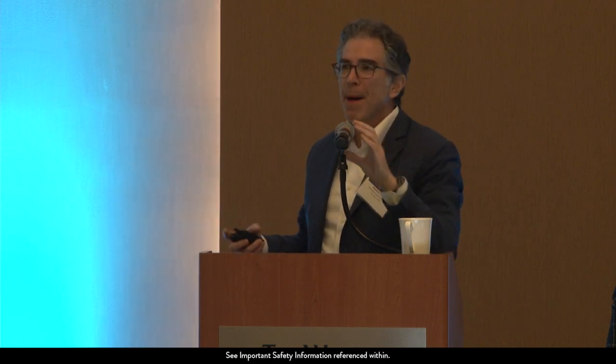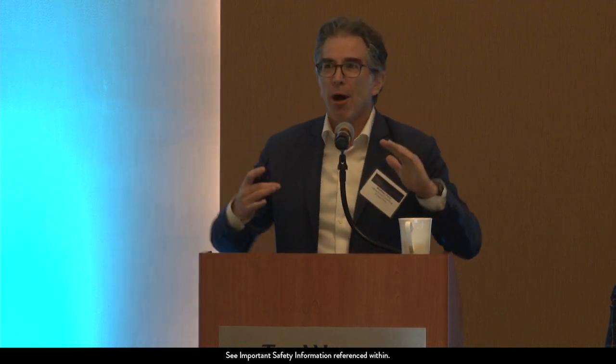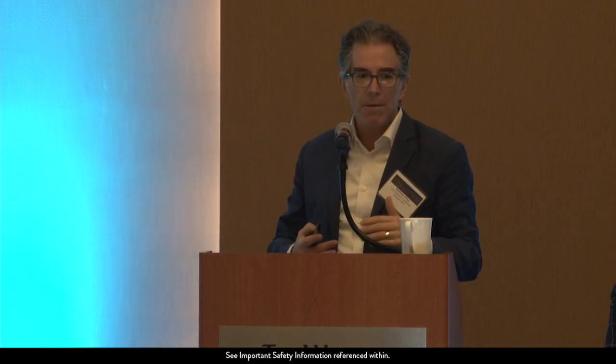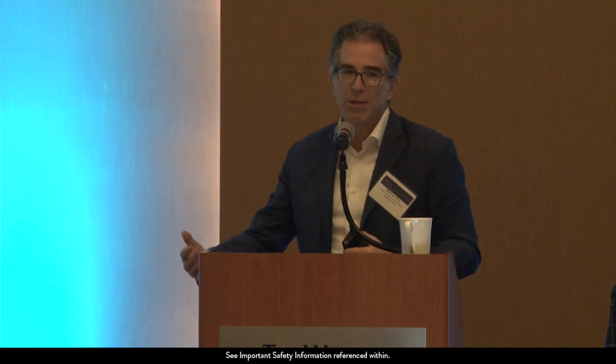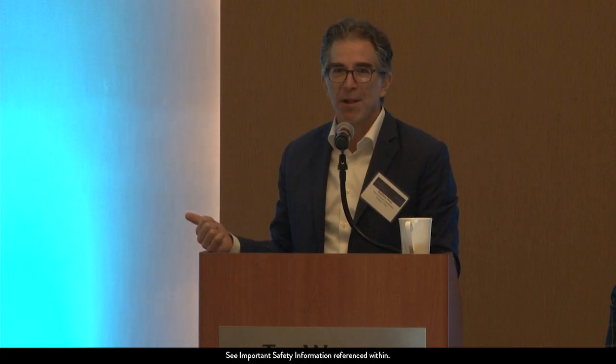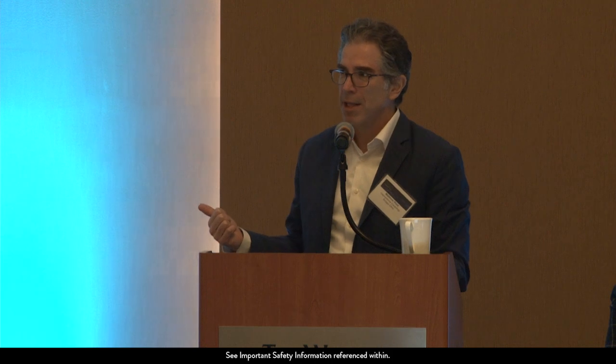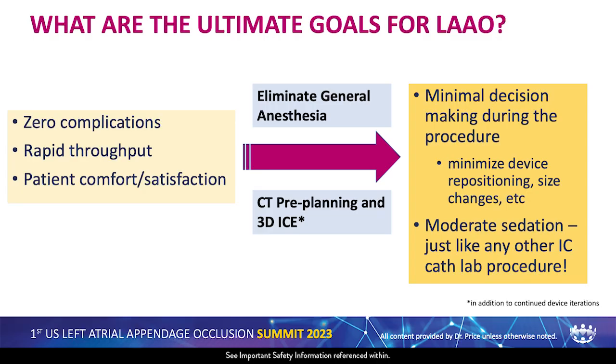But stepping back, how can pre-planning really help us? There's now, and then there's five or ten years from now, and some of us are doing this now. What we want when we do LAO is no complications. It's a prophylactic procedure, all right? And they're not making anybody feel better when they leave your lab. So zero complications, rapid throughput.